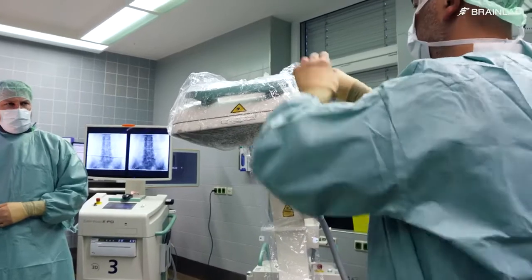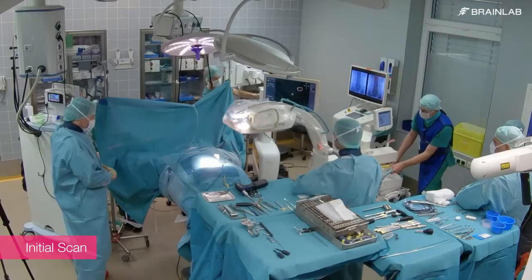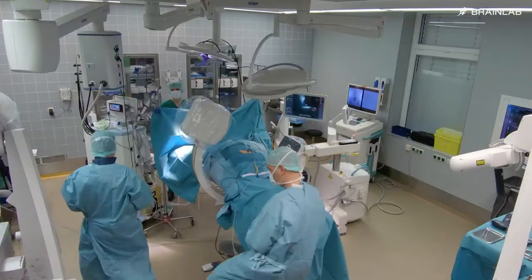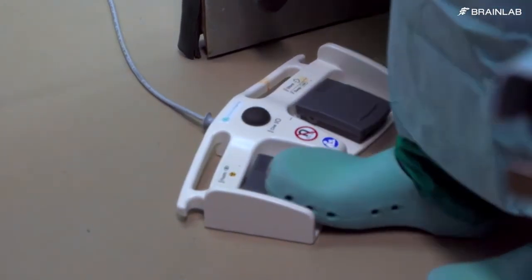The C-arm is draped and a sterilizable tracking array is mounted on the side facing the infrared camera. The C-arm is then moved into position to obtain an intraoperative 3D scan. To protect the surgical team from radiation exposure, the C-arm is activated with a foot pedal from outside the room.